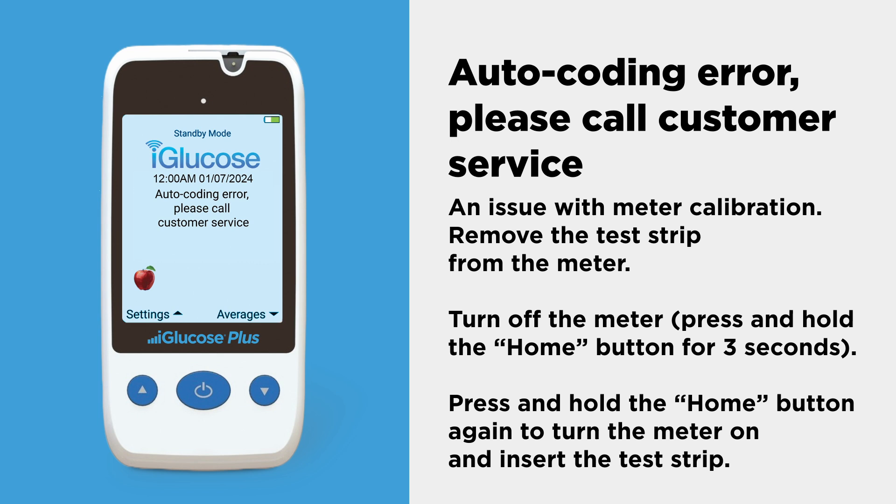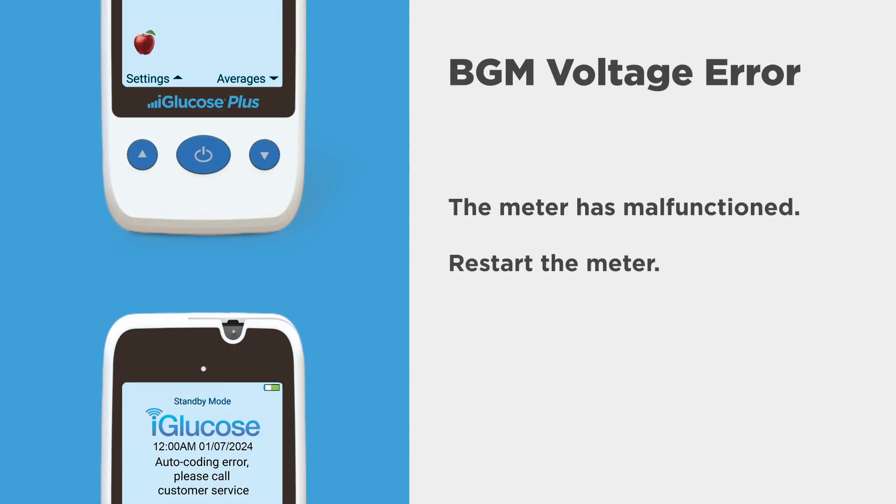If there is an issue with meter calibration, remove the test strip from the meter and turn off the meter. Press and hold the home button for three seconds. Press and hold the home button again to turn the meter on and insert the test strip.